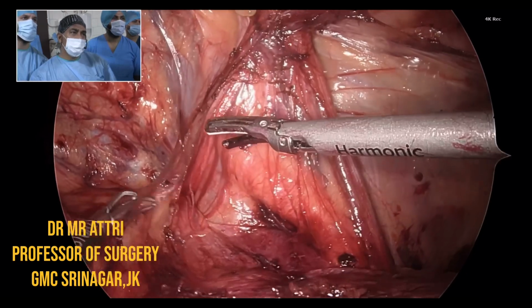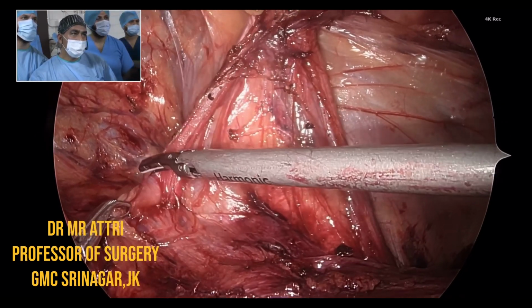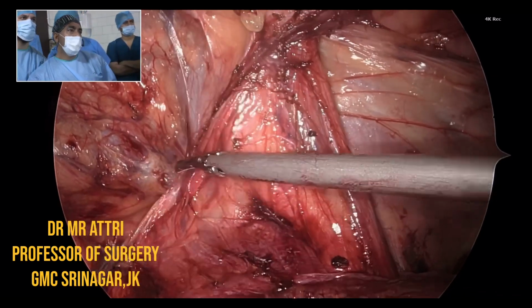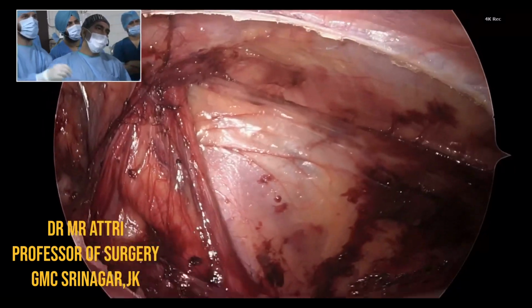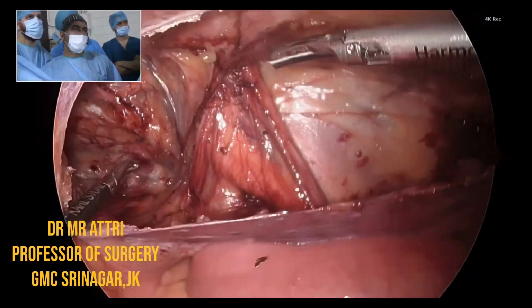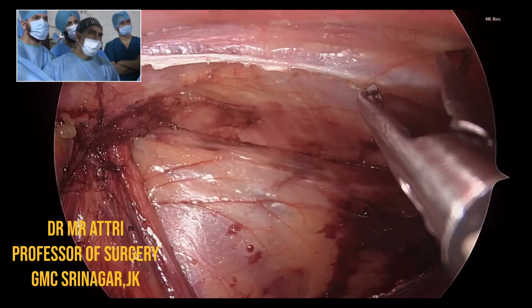Professor Atri, just bear with us because we'll be leaving you for some time. Right, sir. Okay? So please bear with us for a few minutes. I'll be placing a 3D mesh from Medtronic and fixing it with the tacker, and then closing the peritoneal flap here. We are closing the first session of today.